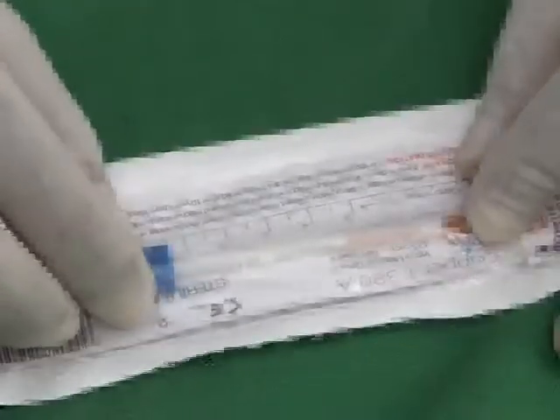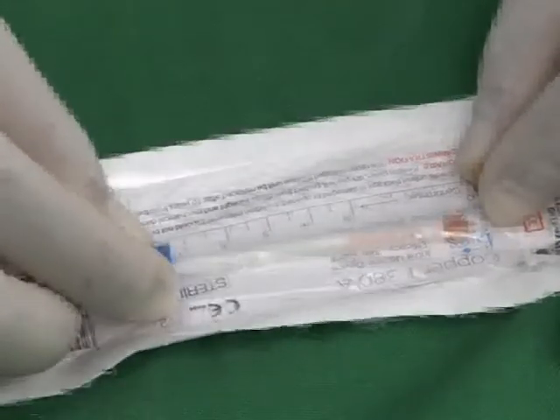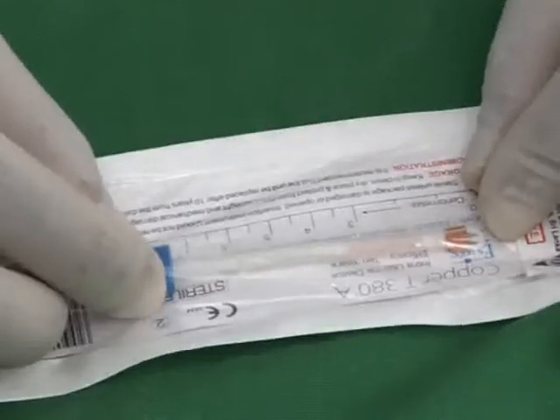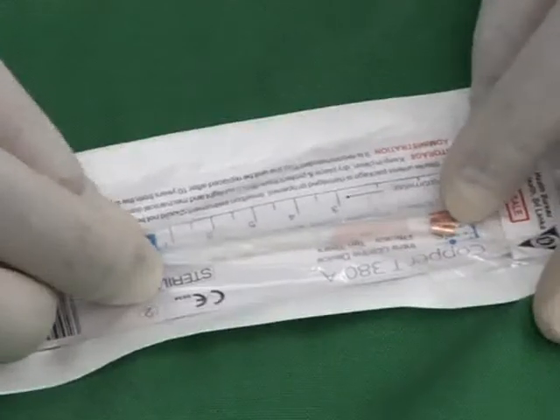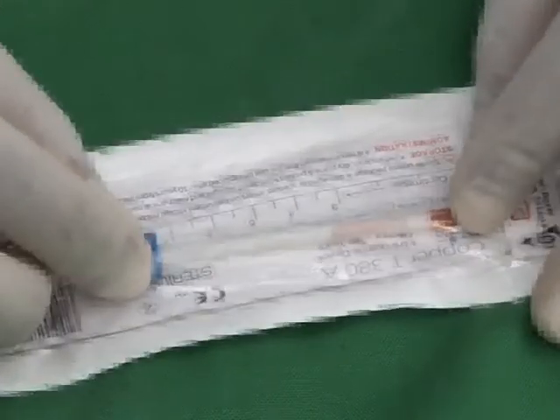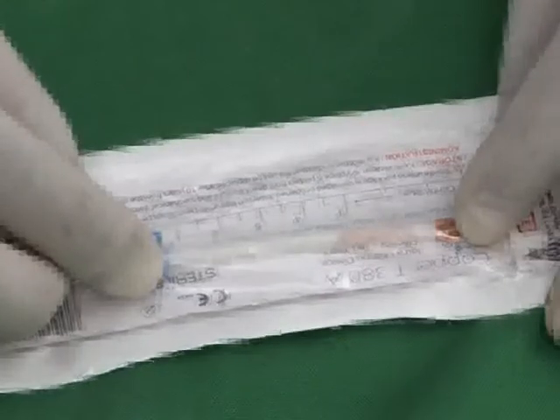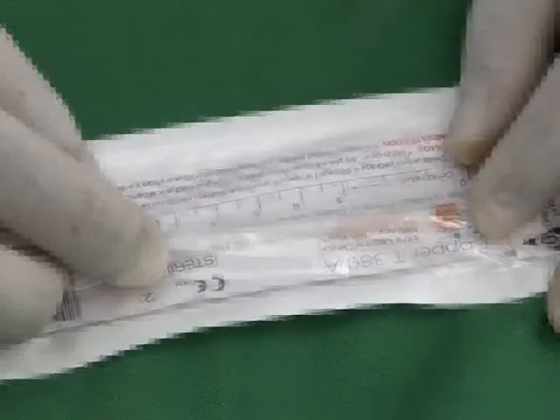It is also important to keep the blue colored movable part horizontal, in the direction of the horizontal arms. Once you have done this, the loading is complete and the intrauterine device is ready for insertion.